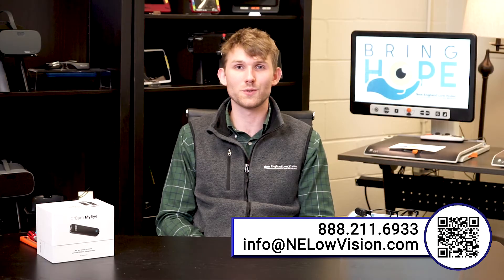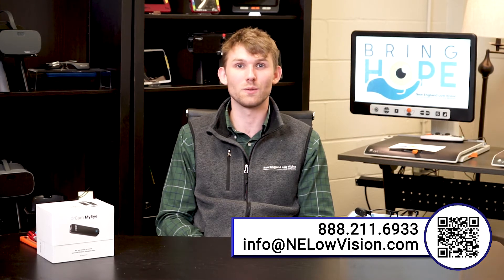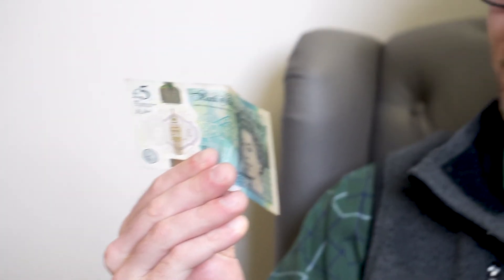A lot of the OrCam MyEye's features help people with low vision become more independent. One of those features is bill recognition — it's quite easy. All you have to do is hold the bill right in front of the OrCam and it will tell you how much money is in your hands — it says "One dollar." To spice it up, I have a five pound note here — it says "Five pounds."